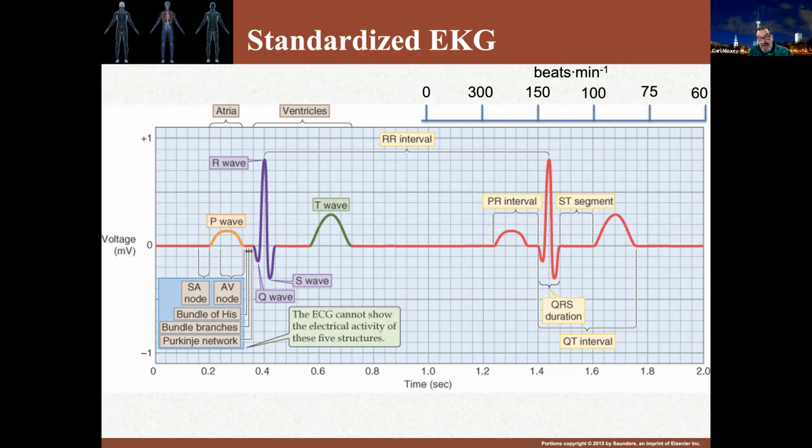The QRS complex, QRS here, actually has, well, you won't always see it so clearly, but has three clear deflections that follow after the P wave. And these are an indication of ventricular depolarization and ventricular contraction.